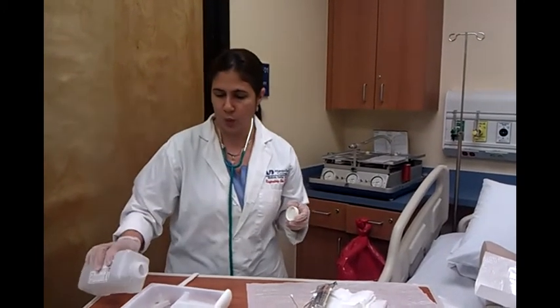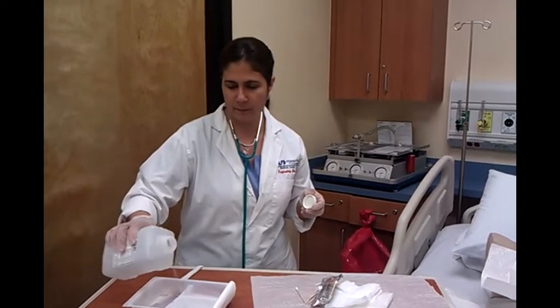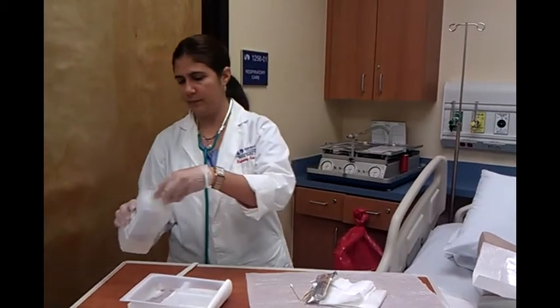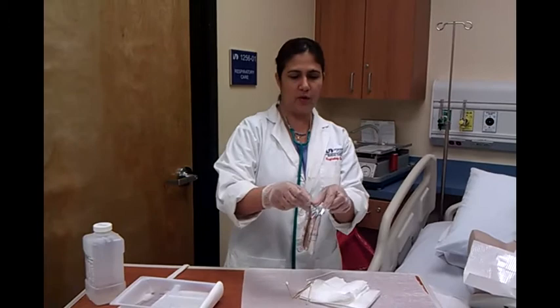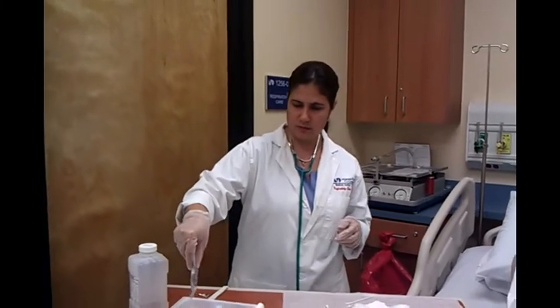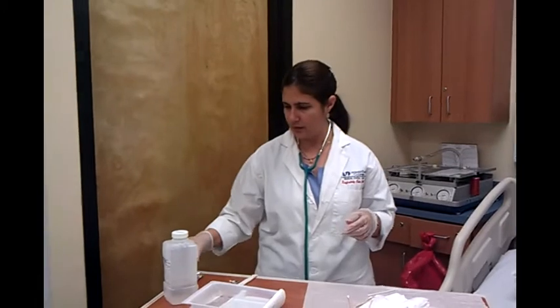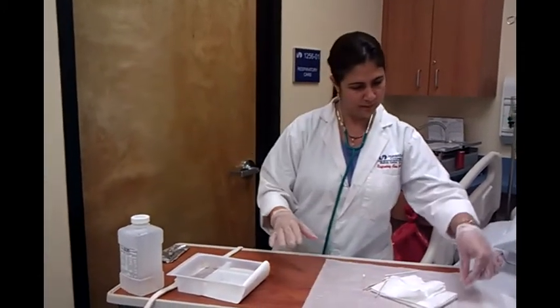I'm going to put sterile water in the first compartment, and in one of the compartments I'm going to put peroxide. And I'm going to put on my sterile gloves.